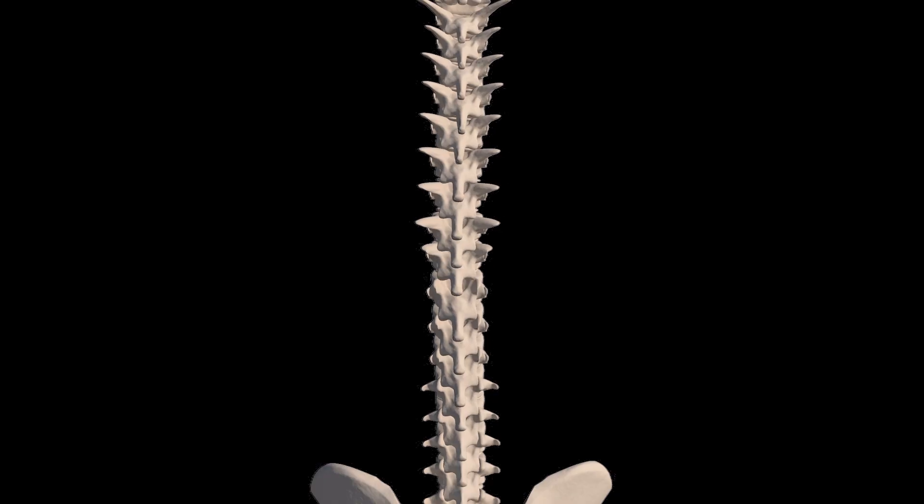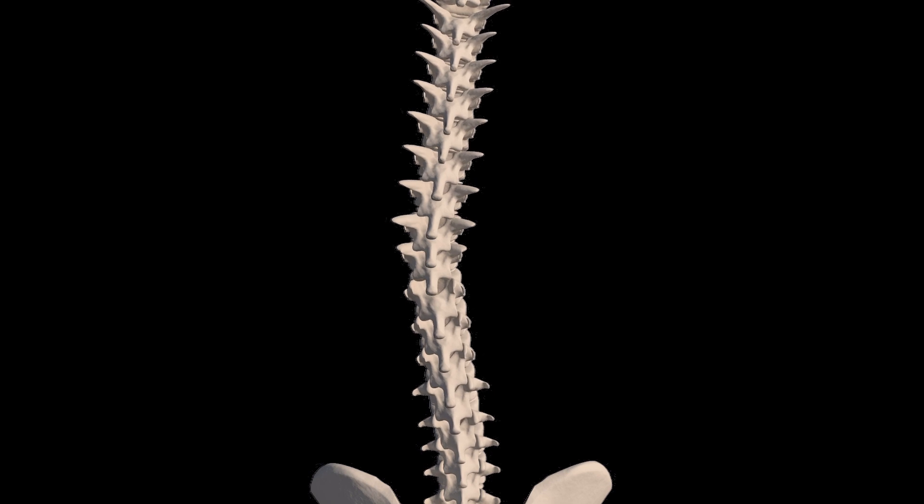The key thing to understand is that scoliosis is a three-dimensional problem — there's a bend and a twist occurring, and this is true in every case of scoliosis; there must be both. The theory behind TLSO braces is that they apply pressure along the spine at specific locations to try to stop the scoliosis from progressing.